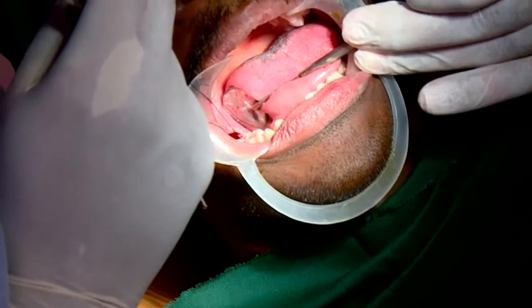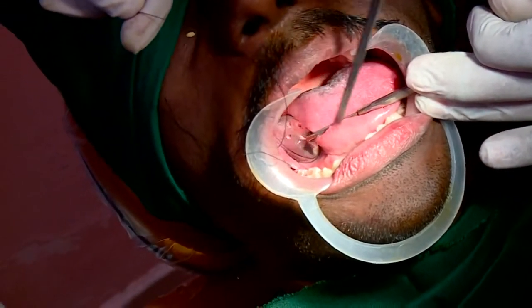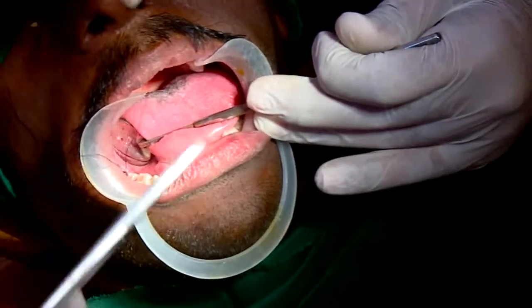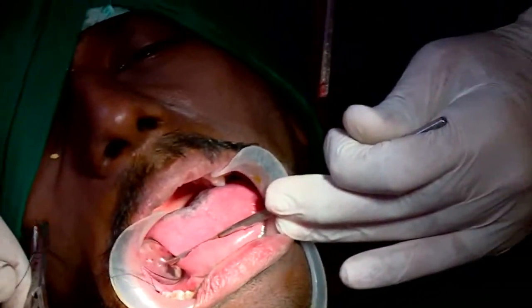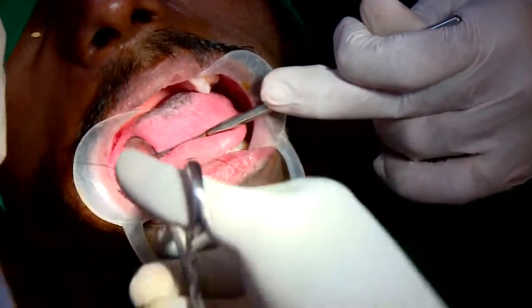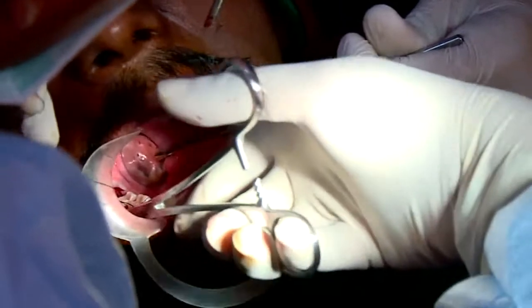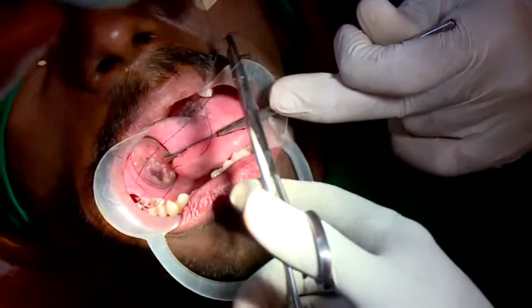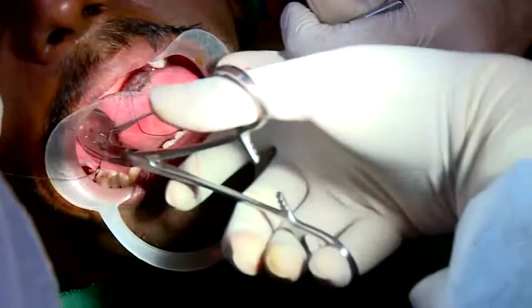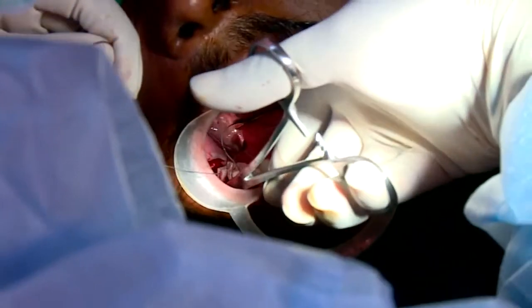So why do we need to suture? Usually why do we suture? Approximation of the edges. Yes. What kind of healing happens when you approximate edges together? Primary healing. Primary healing is much more convenient, and less fibrosis will be seen.